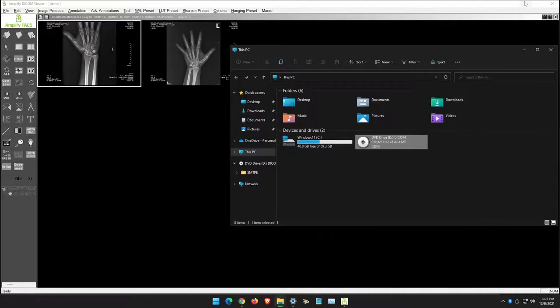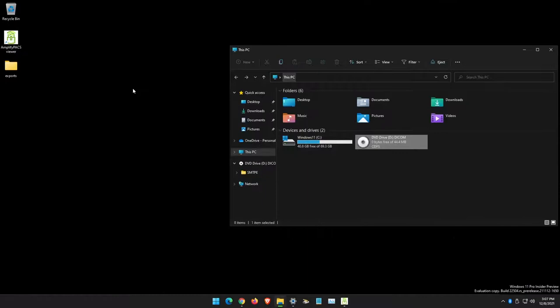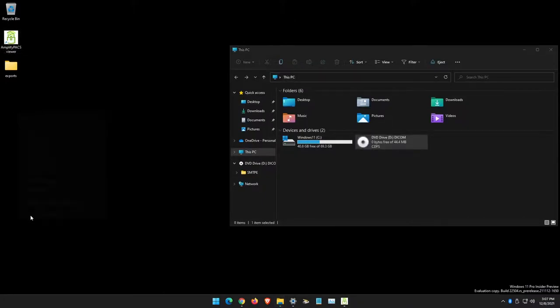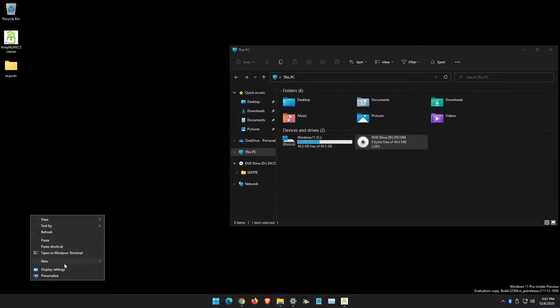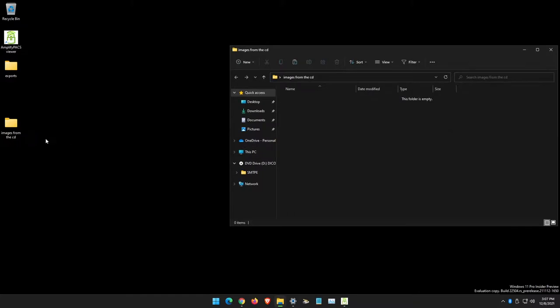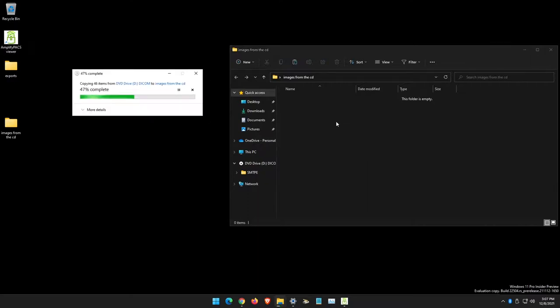Now I'm going to go to my desktop and create a new folder called 'Images from the CD.' I'm going to open that folder and paste the images using CTRL-V to paste the contents of the CD.